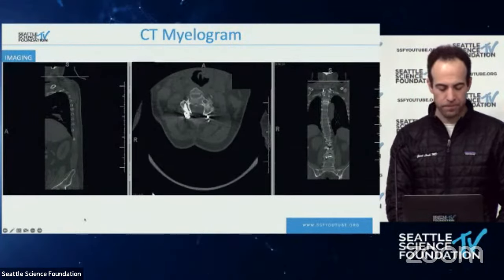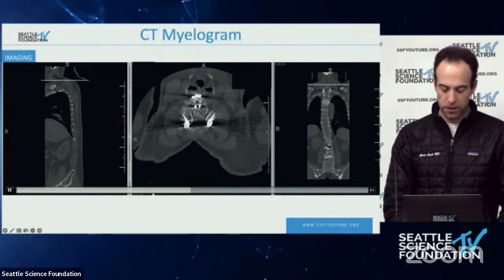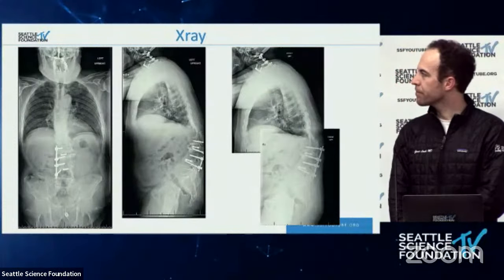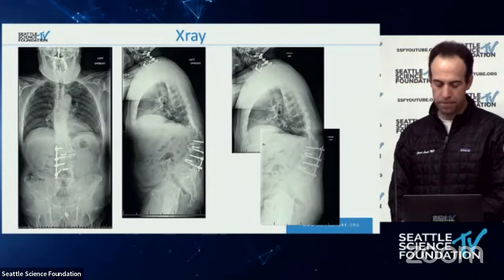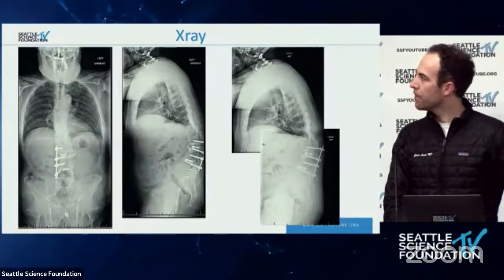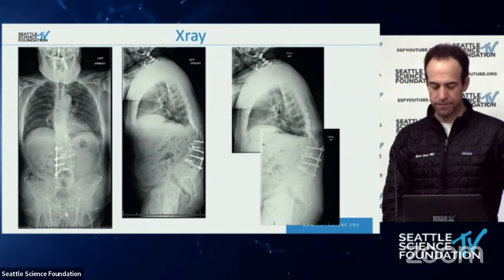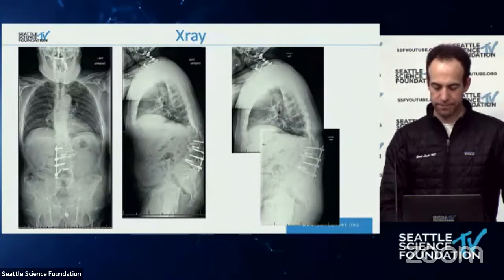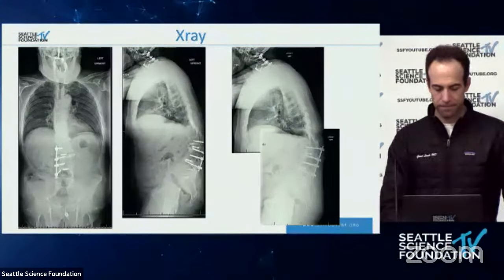Go back to the initial X-rays, yeah. So he's had anterior posterior surgeries and he has an upper thoracic gibbus. It starts at T1. I think the hardware there was not done with a good anchoring function. So the construct stops at T1 and he tipped forwards and he has a substantial kyphosis at T3-4 and at I think T2-3. He has cervical myelopathy without a doubt.